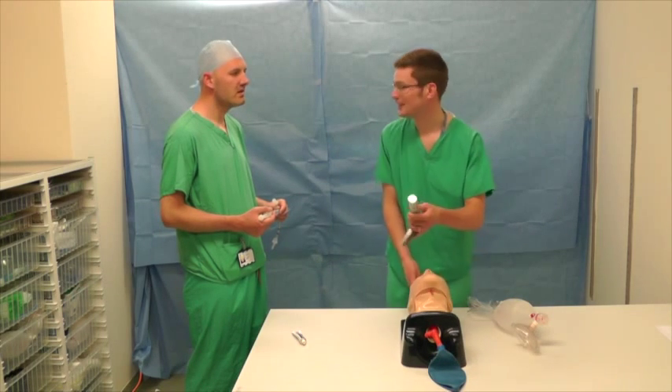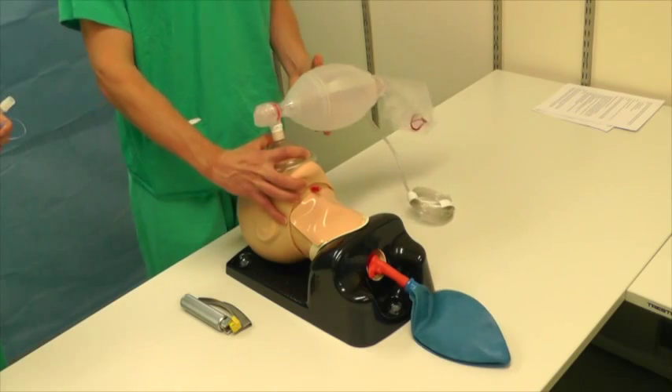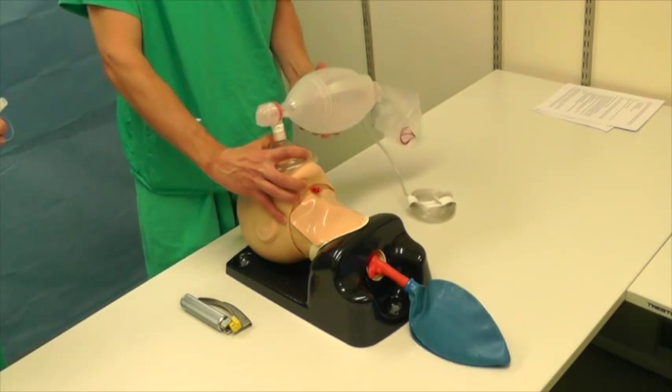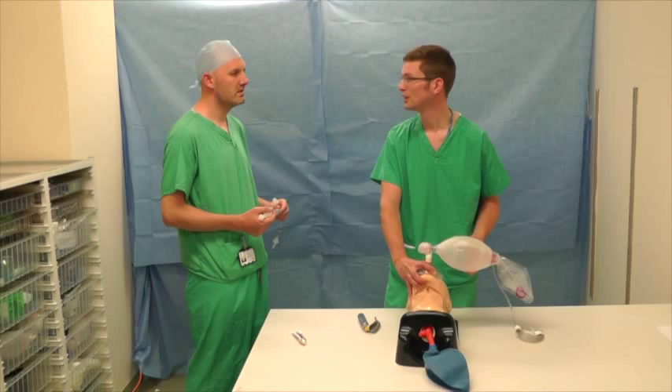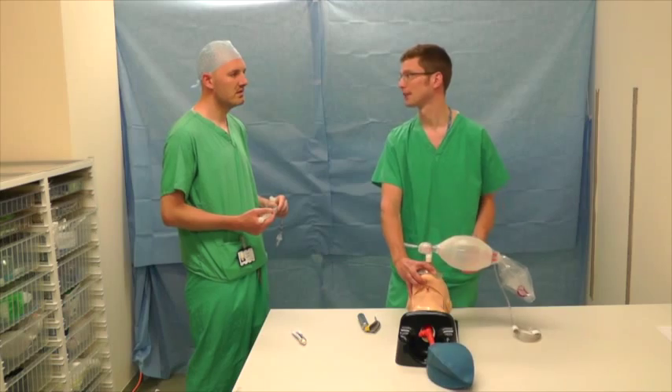I can't see anything, so let's just go back to the beginning. I've had three goes now — let's go for a low-skill fibre-optic intubation using the Aintree catheter. Please get me a fibroscope, a difficult airway trolley and a camera stack.